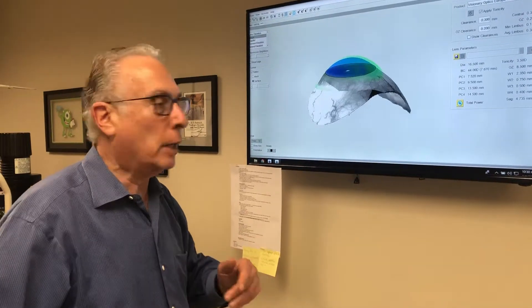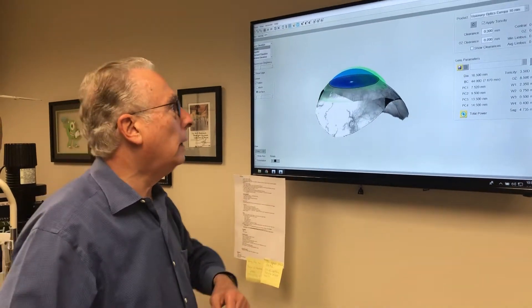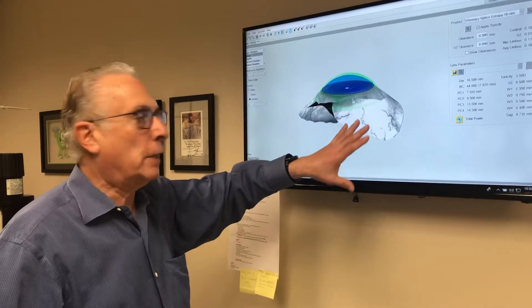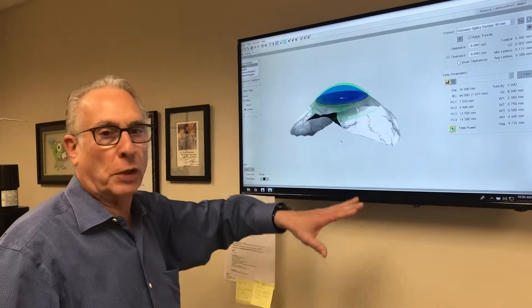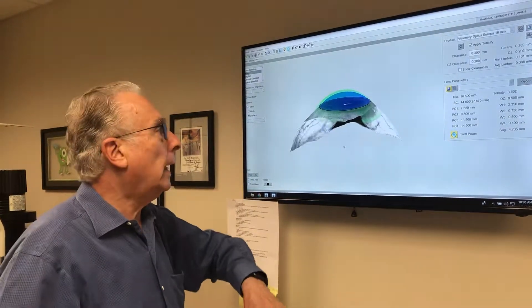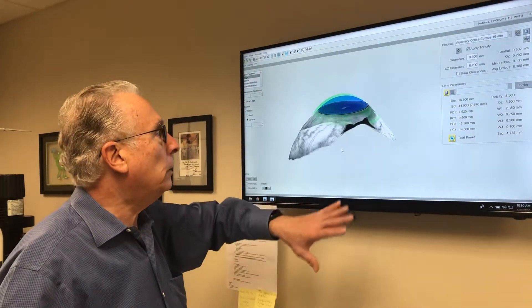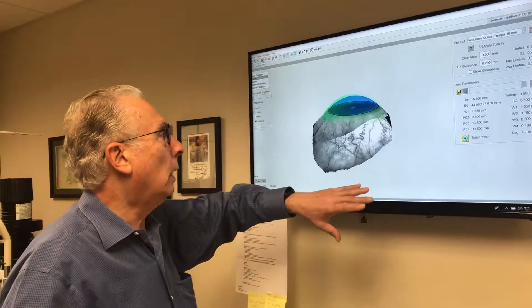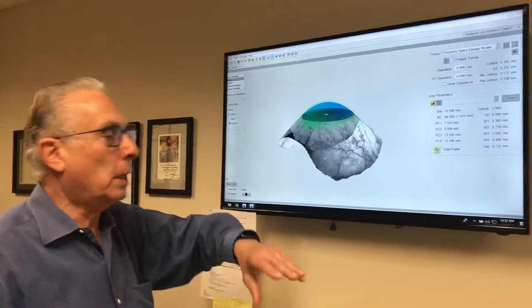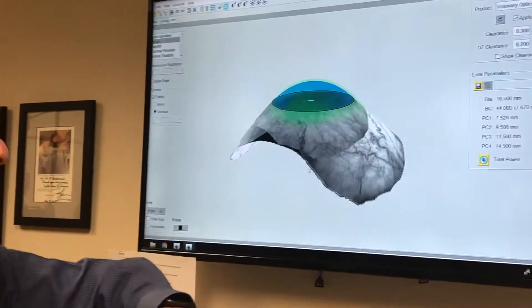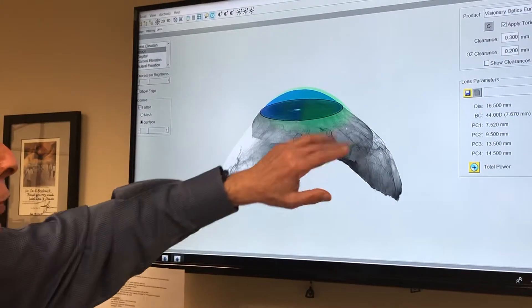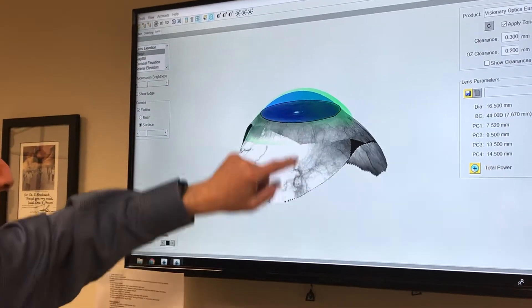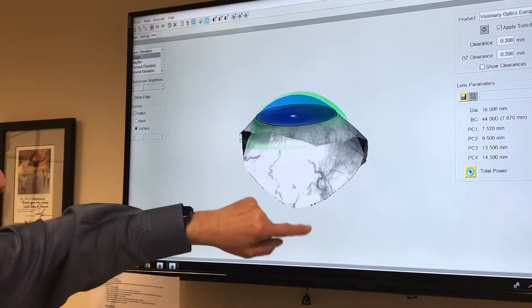Hi, I'm Dr. Boshnik. This image was created with a technology known as the 3D S-Map. We took three images of this eye with the patient looking straight ahead, looking up, and looking down, so you map out not just the cornea — the curvature and the surface of the cornea — but also the white of the eye.